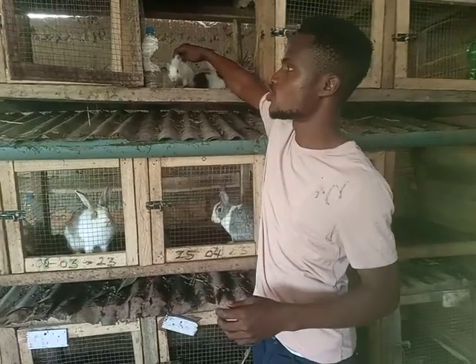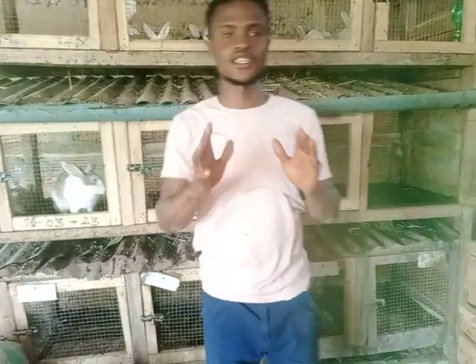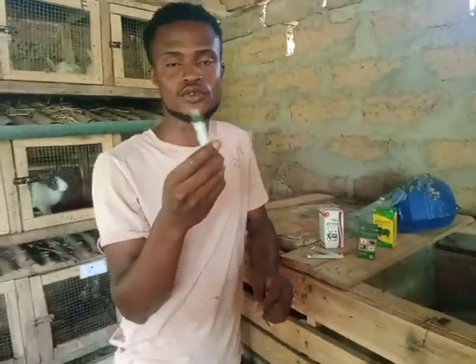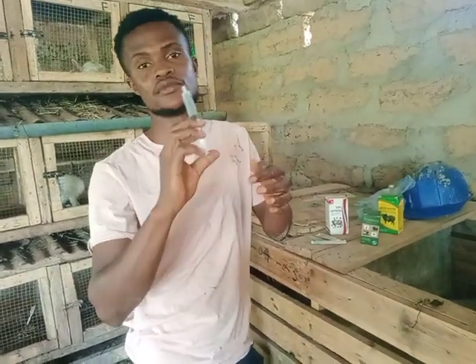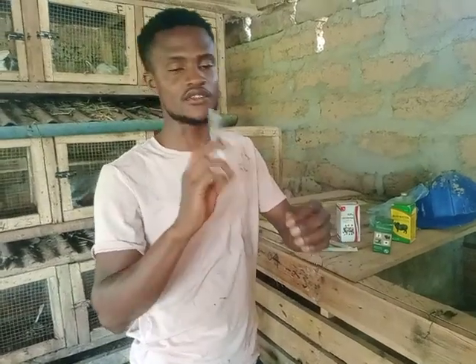Now let me show you — before you vaccinate your rabbits, these are the things you need to first get. Try as much as possible to get a syringe. It can either be 5 mils, 10 mils, or less than that, but just make sure you have a syringe.